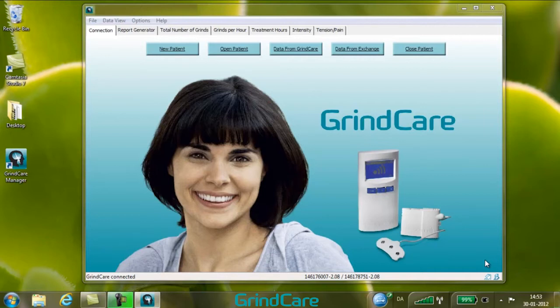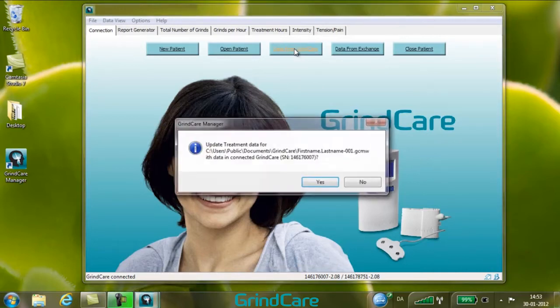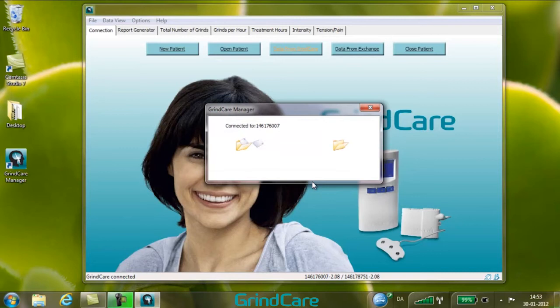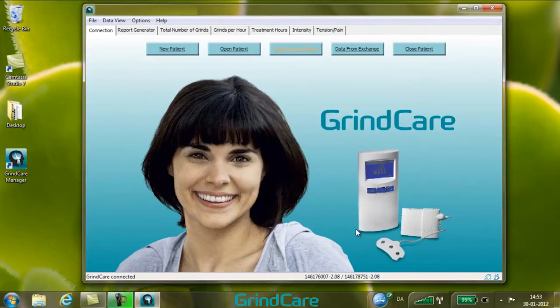To transfer the data from the connected GrindCare device to the active patient in GrindCare Manager, click the Data from GrindCare button. When asked if you want to transfer the data, click Yes. Now, Synchronizing is displayed, indicating the data transfer from the GrindCare device to GrindCare Manager.